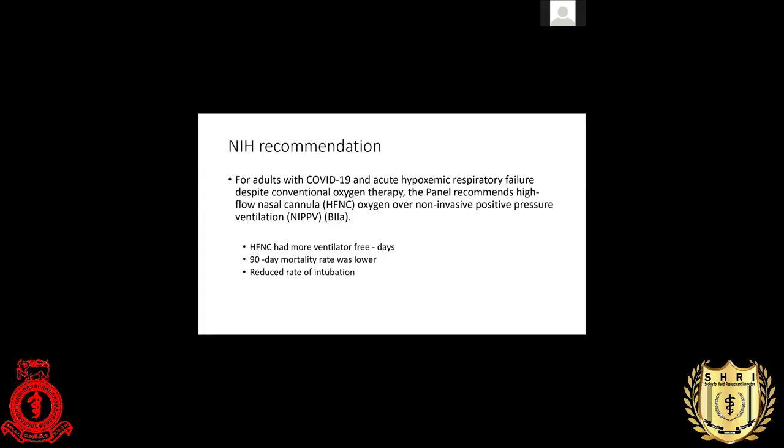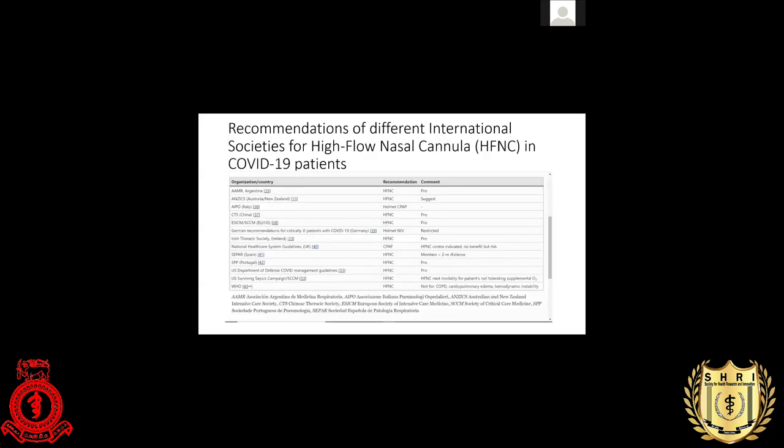And these are other international societies which recommend early use of high flow nasal oxygen cannula or other modality. WHO also recommends using high flow nasal cannula early, and the Australia and New Zealand Intensive Care Society also recommends high flow nasal oxygen cannula.